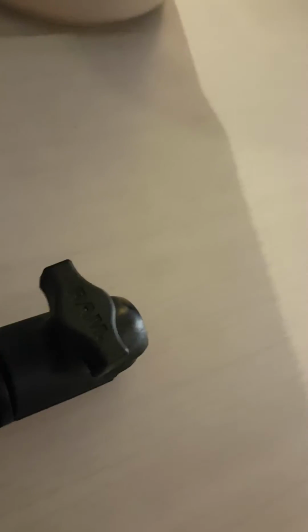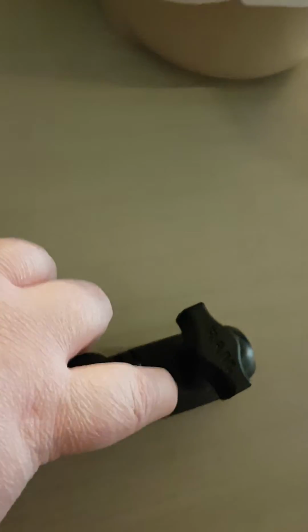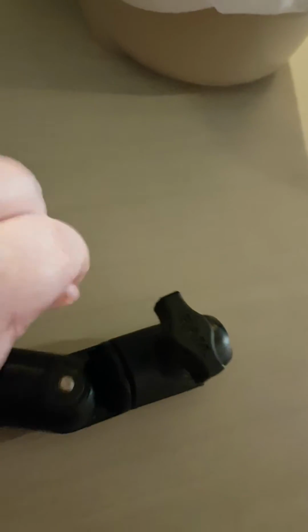So now, I actually had to modify the swivel arm because the swivel is the one part that you don't want tightened. That center joint is the one part you don't want tightened. What happened is that with vibration and movement and everything, that screw at the top kept coming loose. So I'll show you if I can. I'm just twisting off the top screw. There we go.